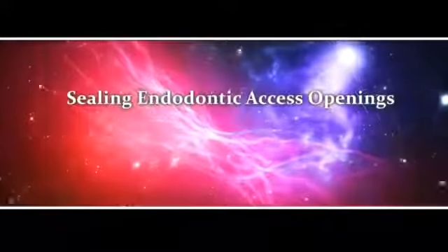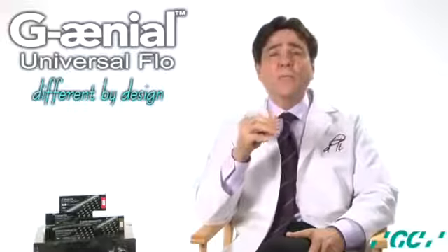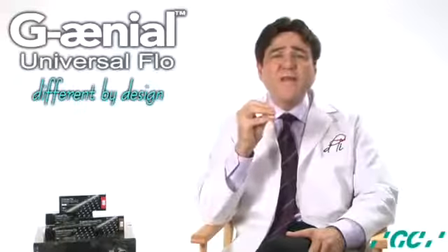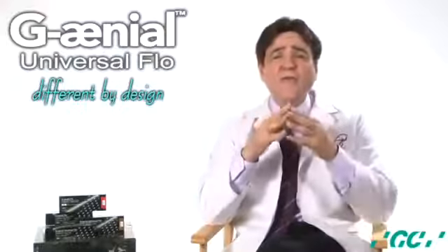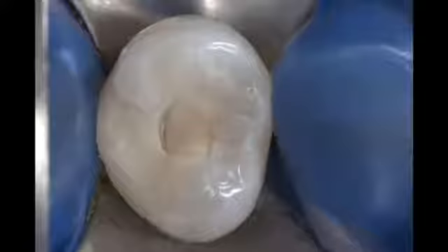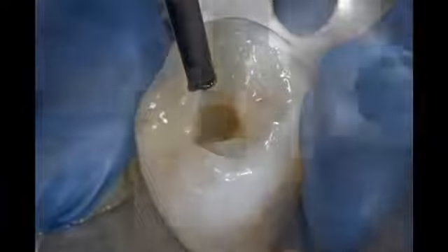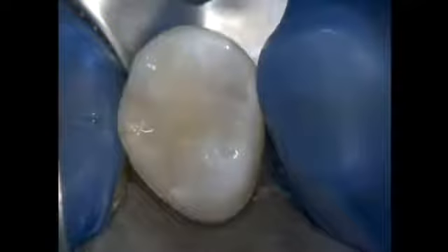Sealing endodontic access openings. An inadequate coronal seal after endodontic therapy can allow saliva to reach the apical region of the tooth in as little as 3 days. One material and method that can be utilized for sealing the endodontic access opening is a simple technique that involves self-etch adhesives such as Genial Bond and a next-generation flowable. This bioadhesive procedure can restore or provide a transitional seal until a new restoration can be placed.